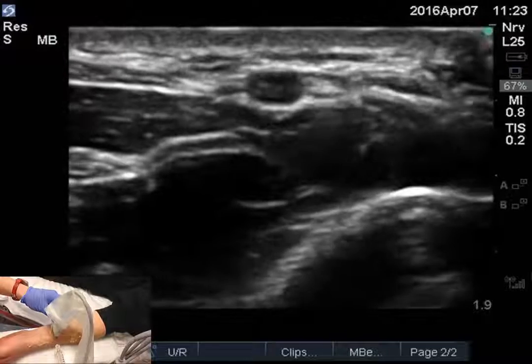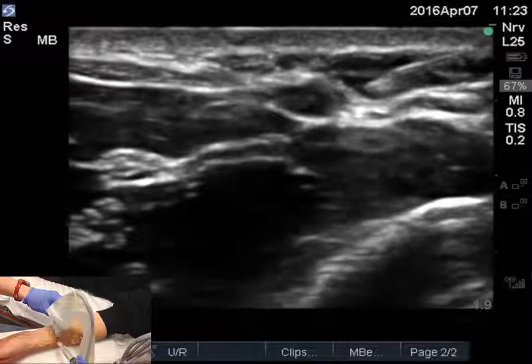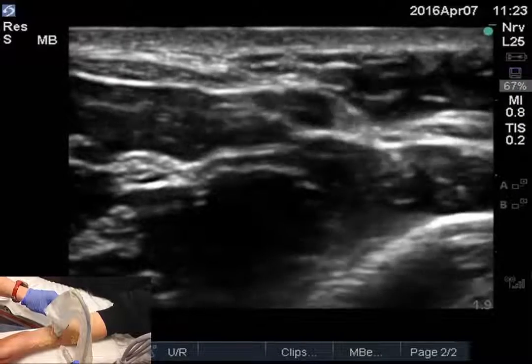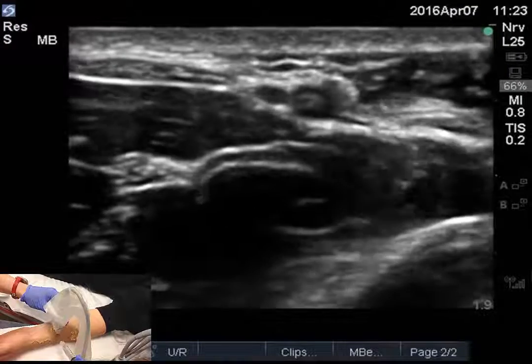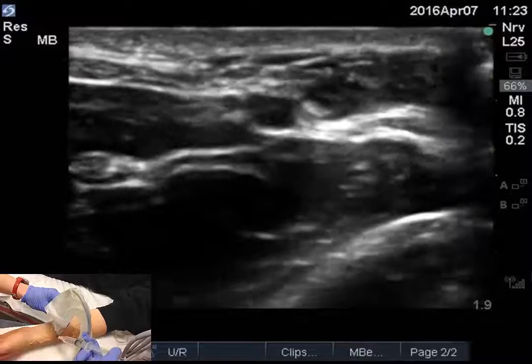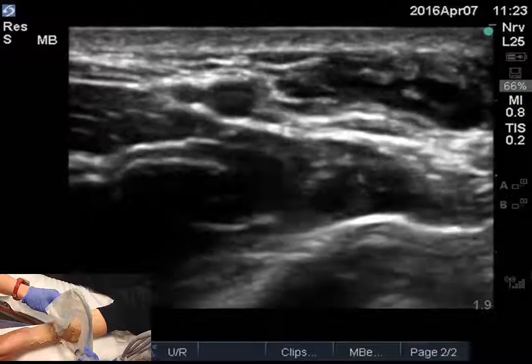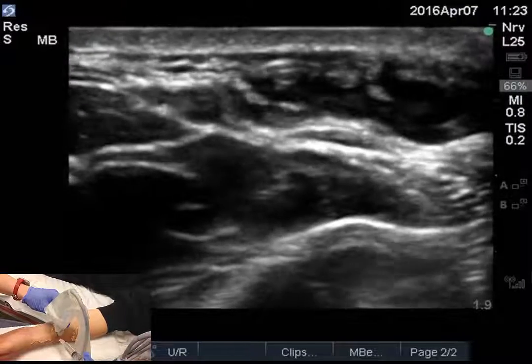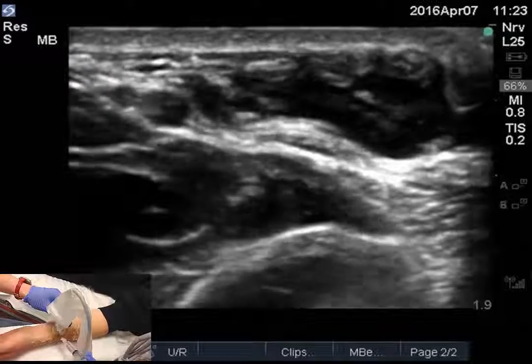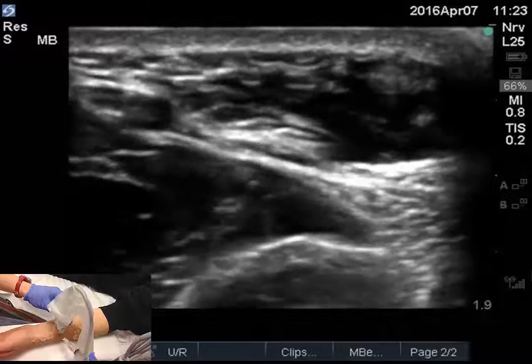Using your dominant hand, insert the needle on the radial side of the probe using the in-plane technique. The in-plane technique will allow you to watch the needle as it advances towards the nerve, helping to ensure that you do not puncture the epineurium. Hydro-dissect the tissue planes. You will need to inject about 2-5 ml of anesthetic. Attempt to get all around the nerve with the fluid, though sometimes you may not be able to completely. Now wait just a few minutes, and then you can be amazed at how well this block worked.